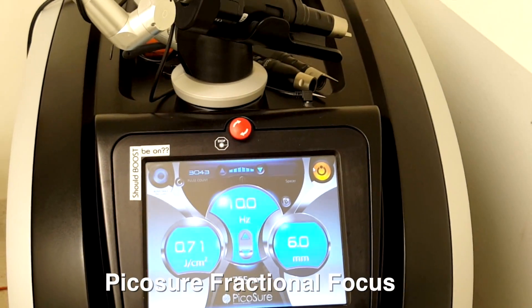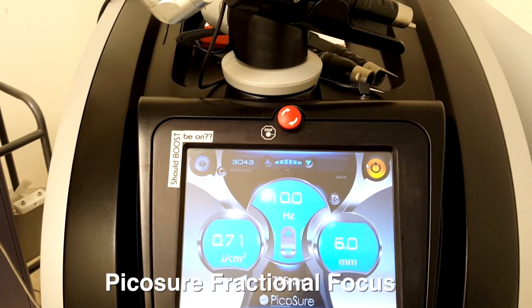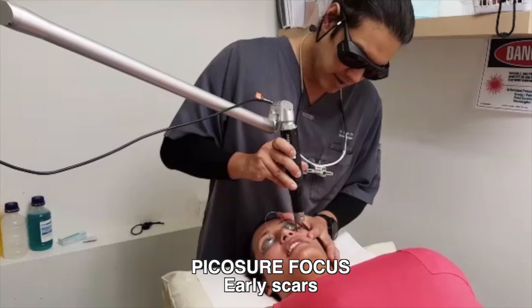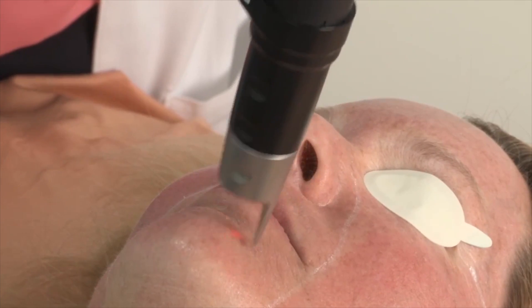Much like the E-matrix is the PicoSure Fractional Focus. This laser has almost no downtime. I use it in fractional mode using the 755 Focus, and I really like this for pigmentation, but I also like this for the treatment of early acne scars. Brilliant.